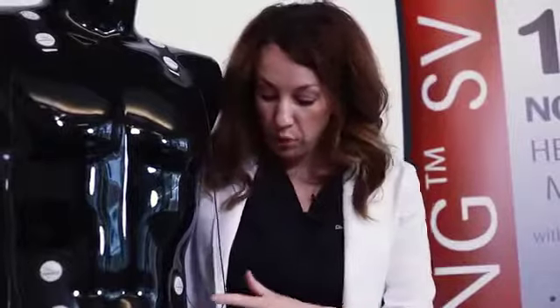For the lower sensors, those typically go at the level of the umbilicus. That is where we want to place the sensor on the lower part of the patient. You do need good skin prep: clean, dry, intact skin is what we're looking for. There is a little emery board that comes in the pack with the sensor, so you can lightly abrade your patient's skin before you apply the sensor. They're good for 48 hours. They can go to CT, they can go to X-ray, they cannot go to MRI. You can place a Tegaderm over the sensor if that will help preserve the life of your sensor a little bit longer. Okay, so that's really good.